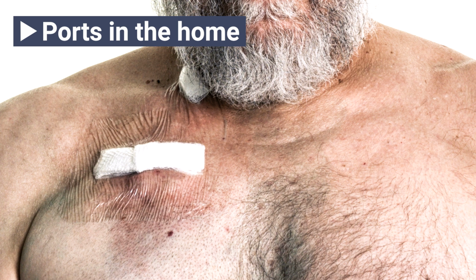To access the port, you use a special needle. Ports are considered central venous catheters. Ports are typically placed in surgery or an interventional radiology center. Ports can stay in place for months or even years. However, if there is a needle in the port, the needle should be changed weekly.